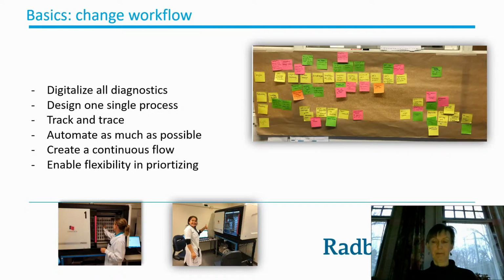But then, of course, being an academic hospital, nothing is just smooth and continuous. And that's why we really had to make sure that in every step it would also be possible to prioritize. If there is an urgent case coming, you really have to break into all your processes.